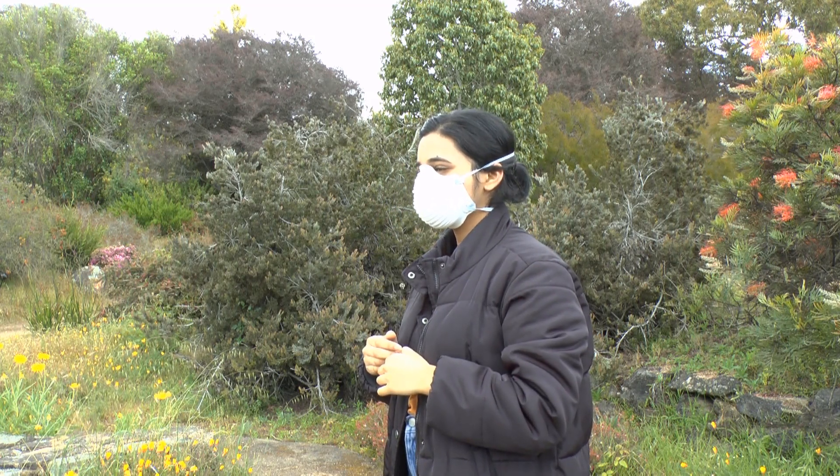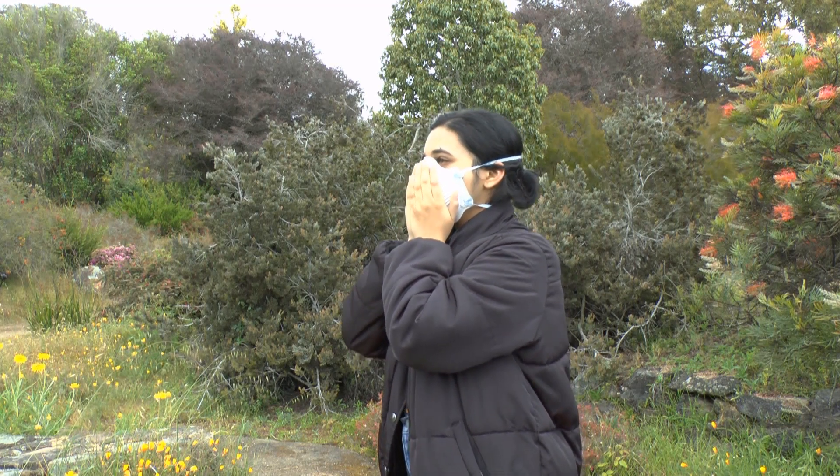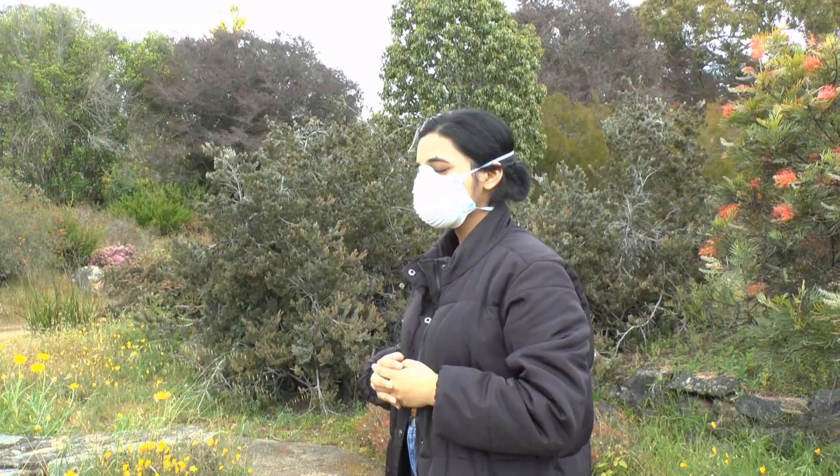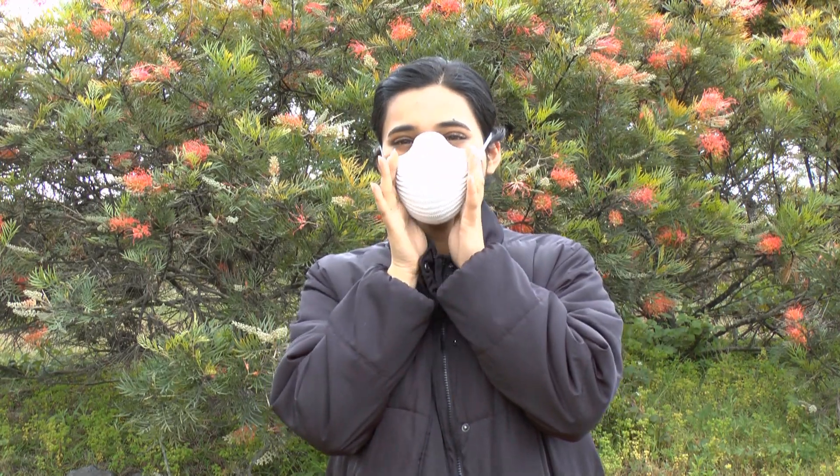Test the fit by placing your hands over the surface of the respirator and take a quick breath. If there is air movement between the edges of your respirator and your face, then the respirator is not fit properly and should be adjusted and tested again.